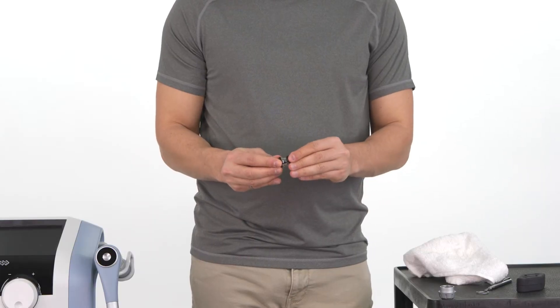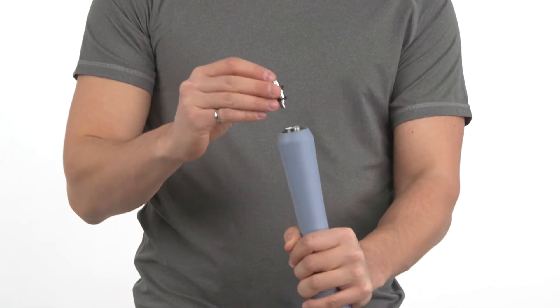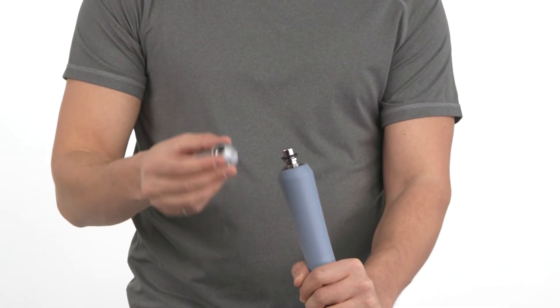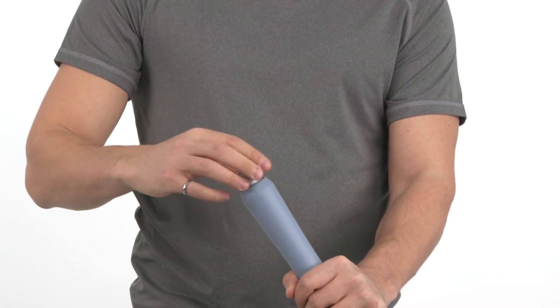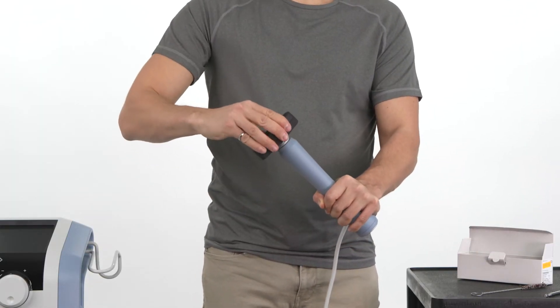Place the washers back onto the transmitter. Place the transmitter back onto the applicator. Place the transmitter holder back onto the transmitter and tighten using your hands. Use the universal wrench for the last few turns to ensure it's well tightened.